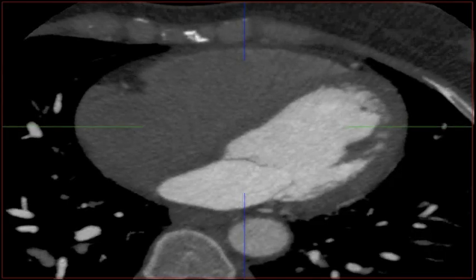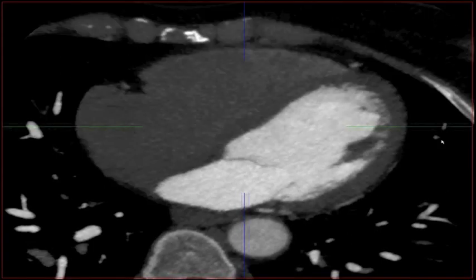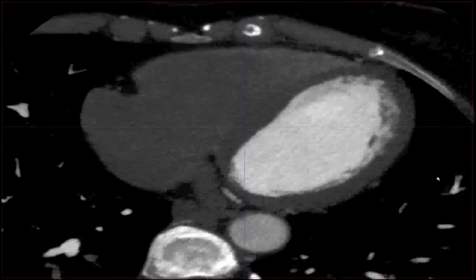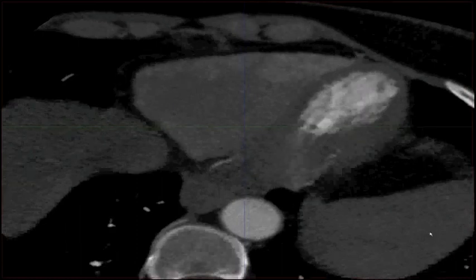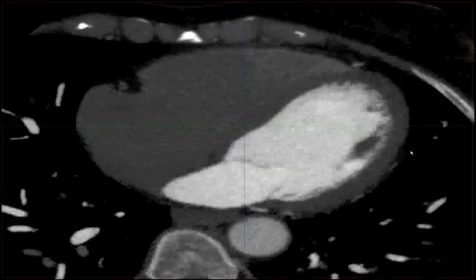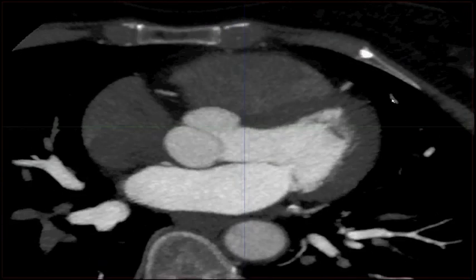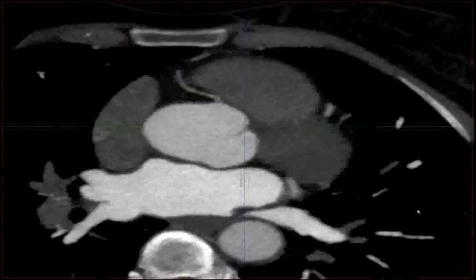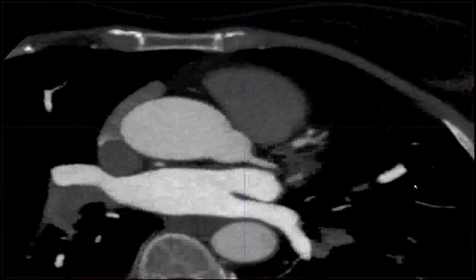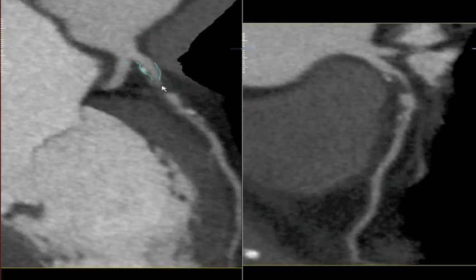Now let's have a look at a more difficult example. Here again, we start off by looking for the calcium. We've increased the MIP and changed the window setting. We can see some calcium coming up in the circumflex artery, but it's a little bit diffuse, and in the LAD there's certainly some calcium and disease, but it's very irregular.